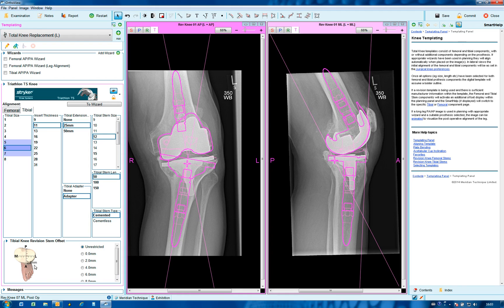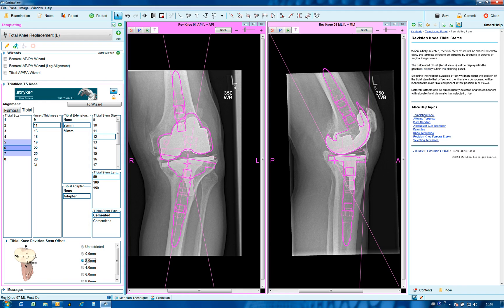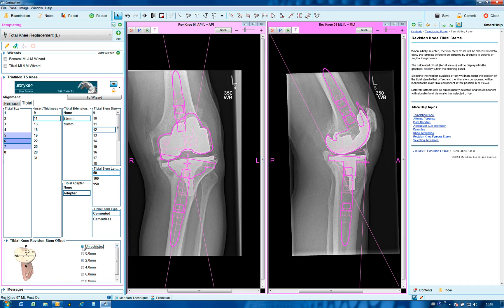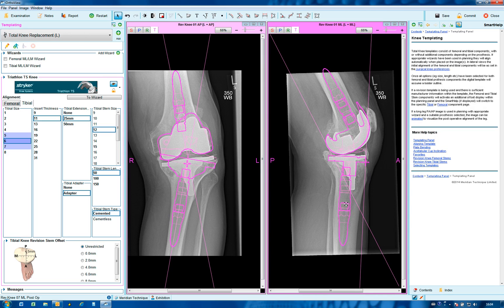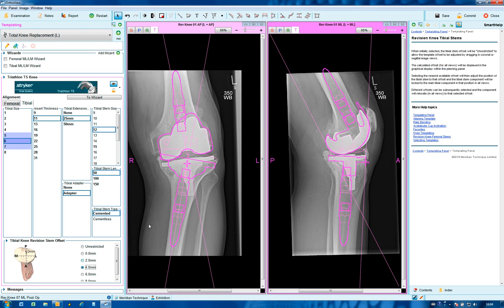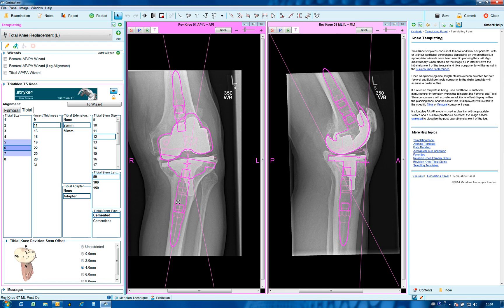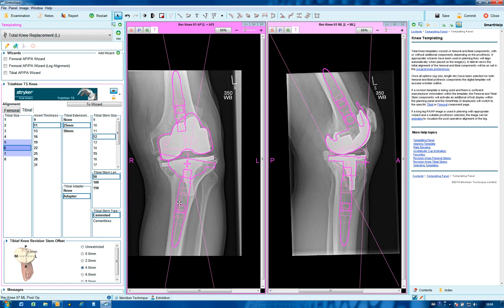2.2 millimeters is shown here, and choosing 2 — being the closest — will move to that position. To view unrestricted in the lateral view, again select and view to see what position is needed, perhaps 4. The combined value of the two offsets is then displayed on the tibial plateau graphic.